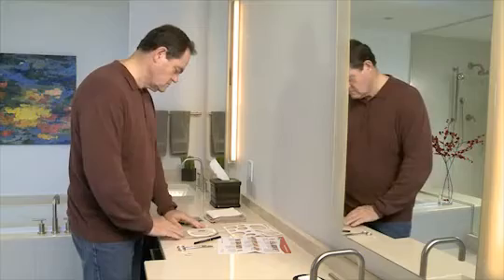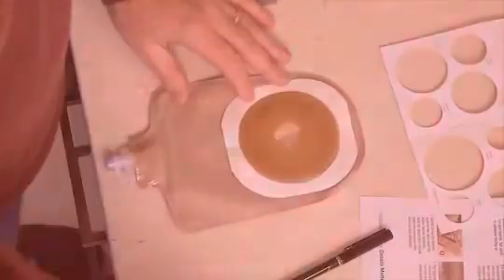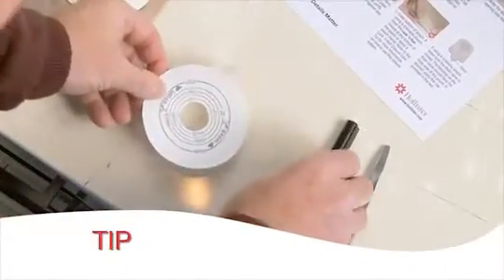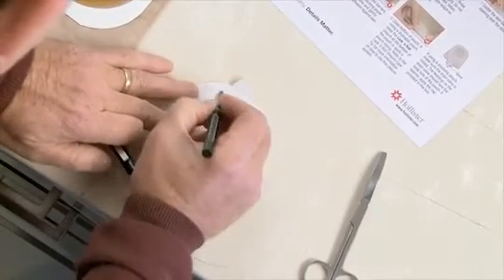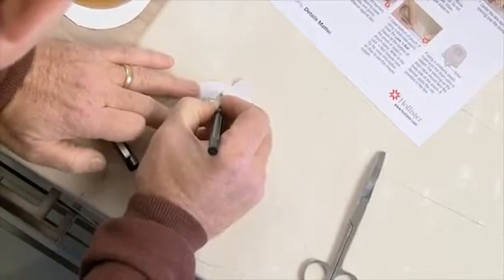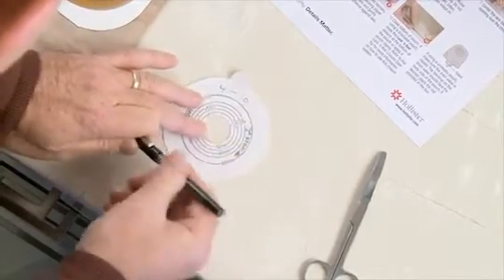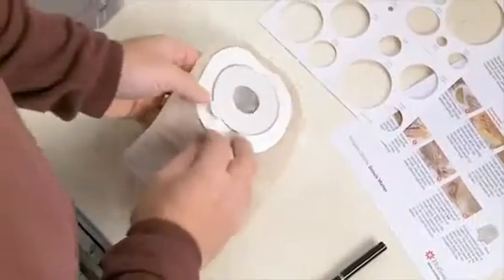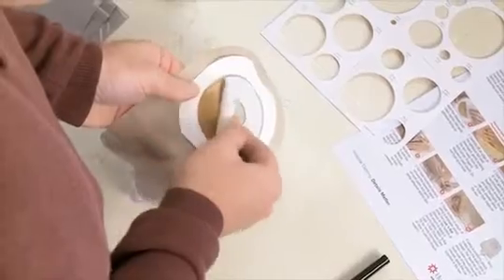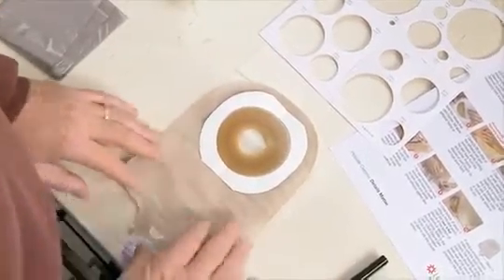Next, remove the backing from the skin barrier. Leave the rest of the backing for now. If you are using a cut-to-fit skin barrier, save the backing paper to use as a pattern for cutting your skin barriers to the proper size. If your stoma is still changing size, date your pattern and throw away old patterns that no longer fit your stoma. If you are using a pre-sized opening, just peel off the backing paper as already described. Set aside with the adhesive facing up.